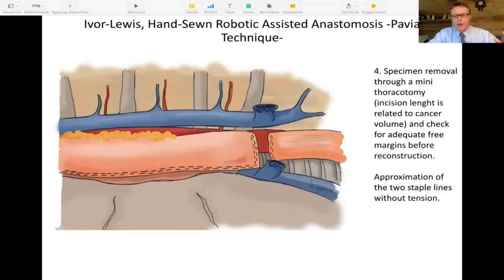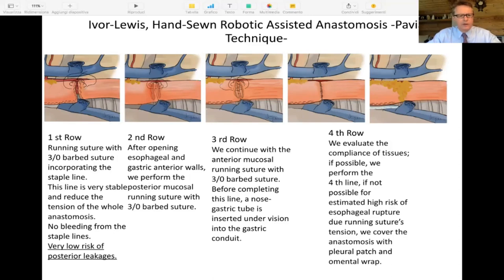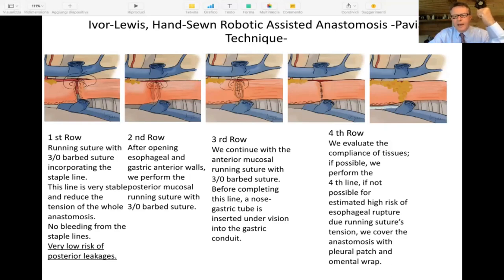The specimen is removed through a mini-thoracotomy, the size of which depends on the size of the tumor but can usually be kept to a minimum of a few centimeters. We then approximate the two staple lines without any tension. The anastomosis is done with three or four layers. The first layer — the most important one — approximates the two staple lines on the esophageal and gastric conduit with a 3-0 barbed running suture. Then we make a cut and approximate the mucosa of the posterior wall, then the anterior wall, and finally if needed we can add omentoplasty or cover the anastomosis with a pleural patch.